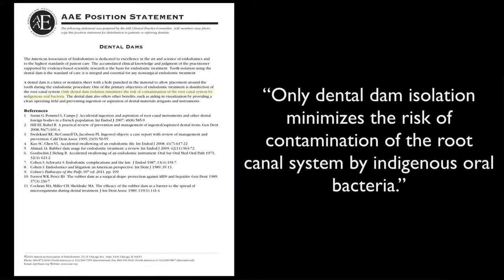In 2010, the American Association of Endodontists released a position statement on the rubber dam. Prior to 2010, the rubber dam was a suggested standard of care. Well, now since 2010, since the American Association of Endodontists has released this position paper, it is now the legal standard of care to use a rubber dam. So you can be sure that if you're not using a rubber dam, you're practicing below the legal standard of care.